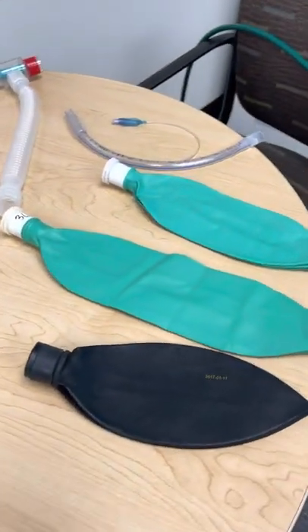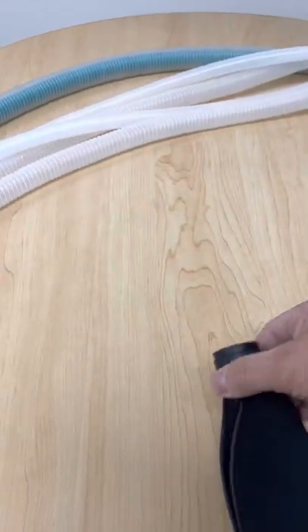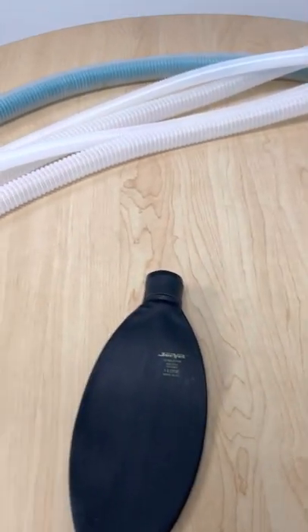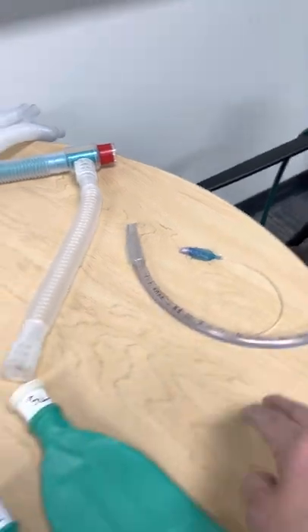All right, we have different rebreathing bags, or some people call these reservoir bags. Okay, this one here is a 1 liter. Then we have a 2 liter and a 3 liter bag. And then we have our endotracheal tube.